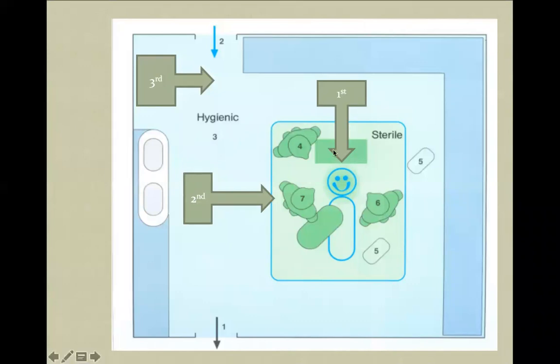And usually the composition of the surgical team is like this. Here we have the patient, and believe me, a patient is a part of the team. Otherwise, nothing will work, nothing. Then we've got a surgeon here, an assistant, and a surgical nurse. Sometimes if you're placing 2 or 3 implants, you really don't need the nurse. It's not necessary, or at least I'm doing it like that. But again, it's up to you.